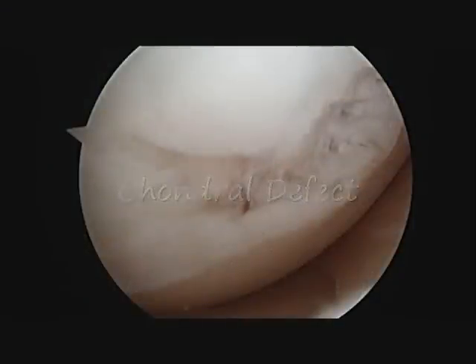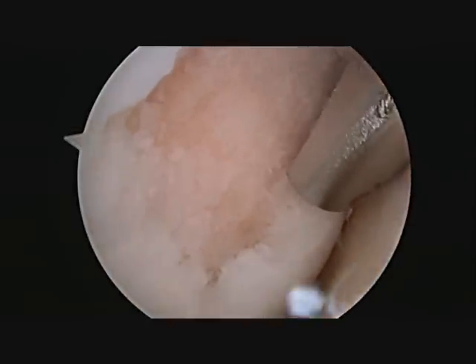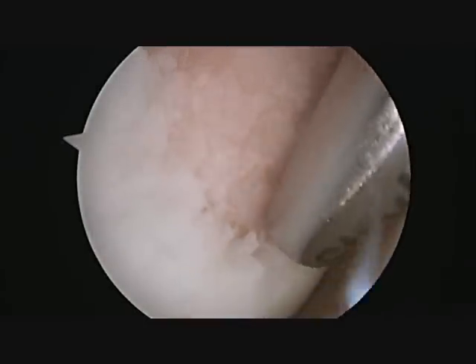This crater-like lesion initially appears to be a small chondral defect. However, after further probing of the defect, it becomes quite obvious that this is a much more significant injury than it seemed at first glance. Clearly, this 2 cm — almost 1 inch — size defect on the weight-bearing portion of the thigh bone has a large amount of loose cartilage that has been sheared off of the bone.